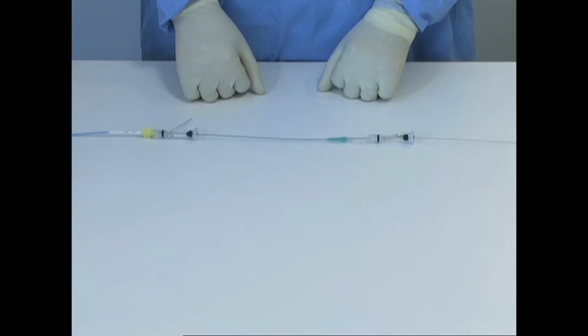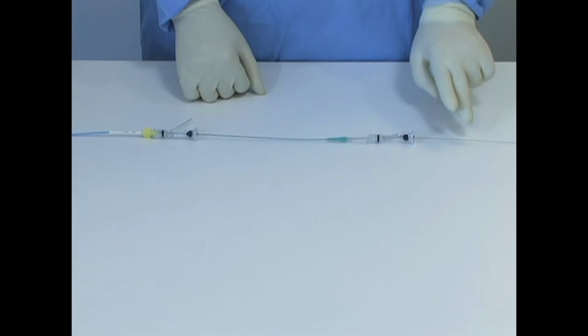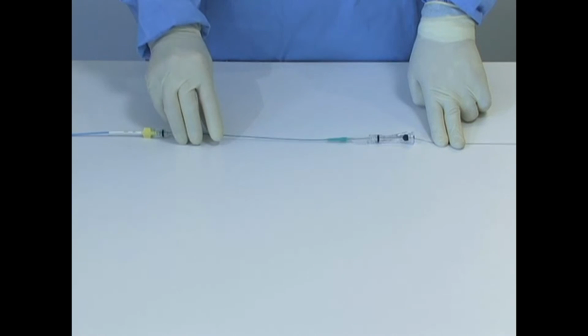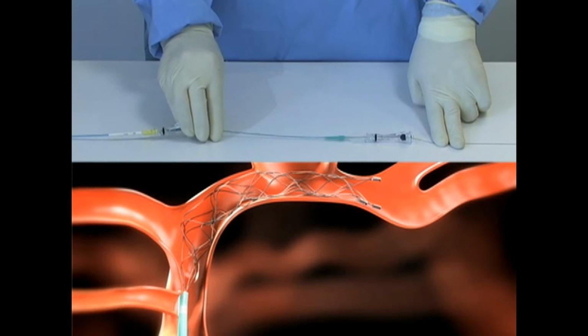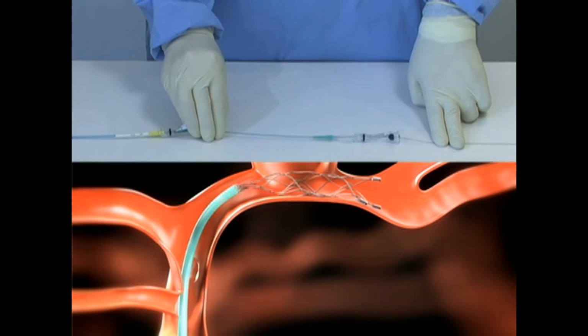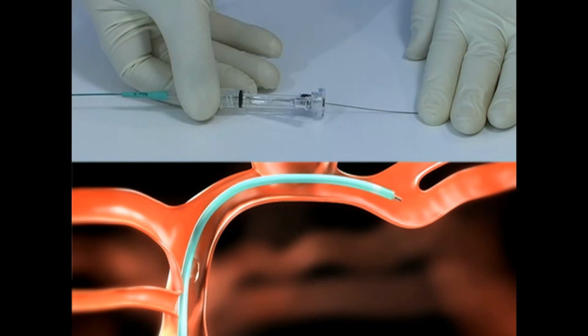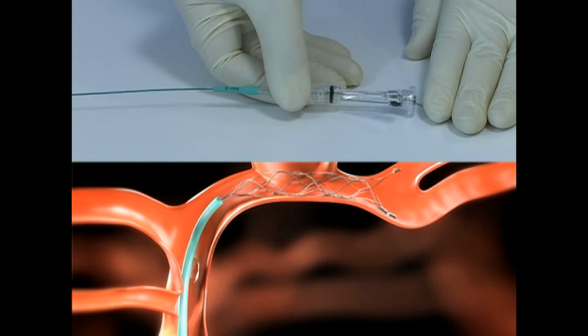With the aid of fluoroscopic monitoring, hold the proximal end of the push wire in its position firmly enough to prevent the Solitaire AB from moving. Then, carefully slide the microcatheter in the distal direction over the Solitaire AB until the distal markers of the Solitaire AB line up at the end of the microcatheter. When positioned as desired, withdraw the microcatheter in the proximal direction.